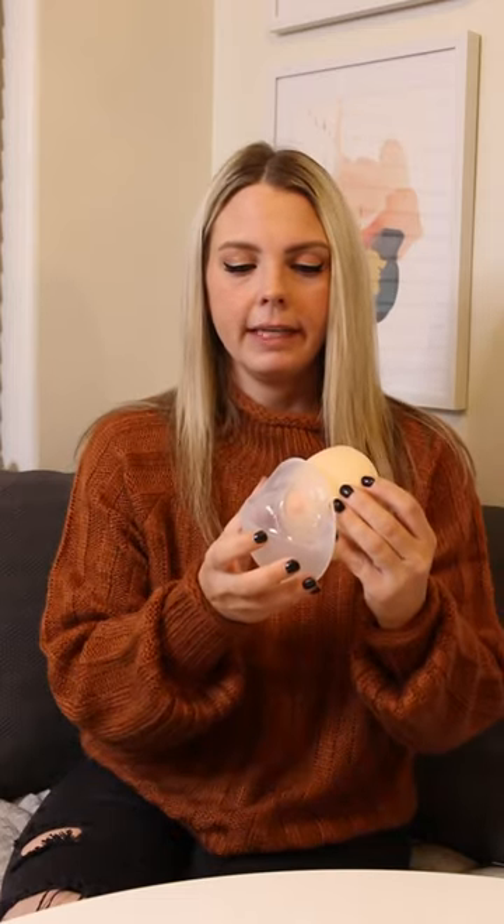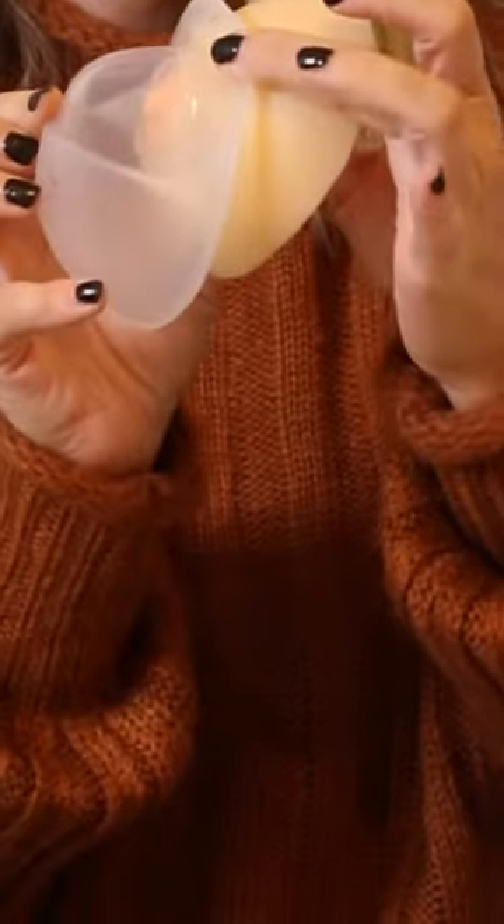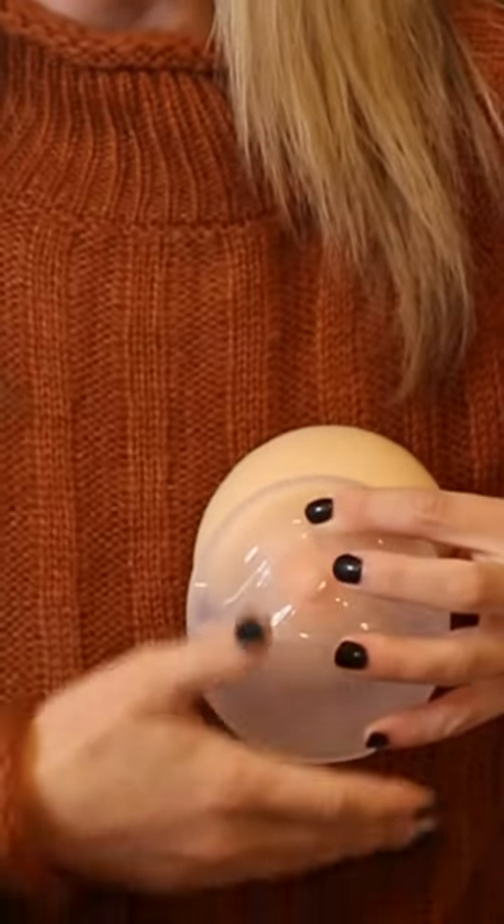If you're somebody who tends to be very leaky, or if you nurse on one side and when you have a letdown a lot of your milk is getting wasted into a nursing pad, then using it passively — by just placing it up against your breast, centering your nipple, and securing it with your pumping or nursing bra — is going to passively collect those drops that would have otherwise been wasted into your nursing pad.